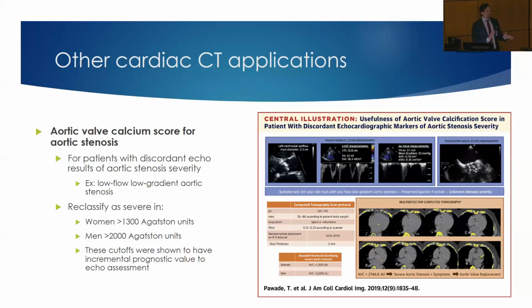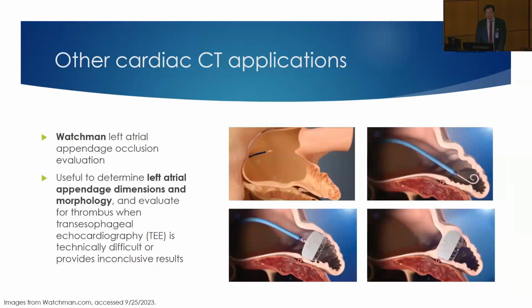So if your echo measurements are borderline or inconclusive, you do a calcium score and it's extensively calcified, that is most likely severe. They should probably get a TAVR, or maybe they're a good surgical candidate as well.